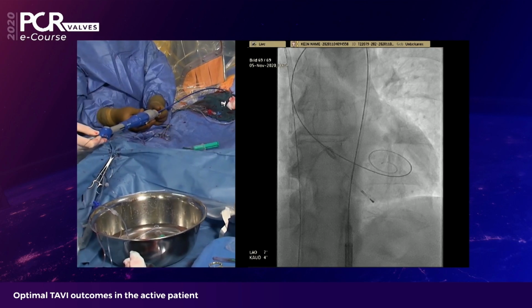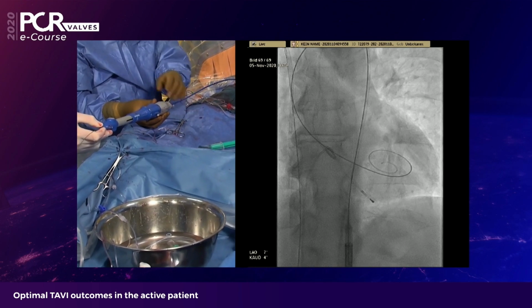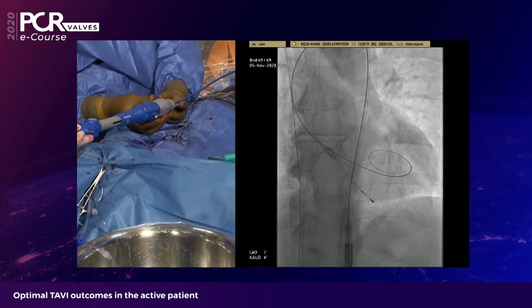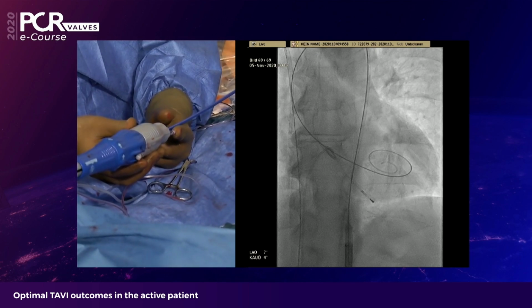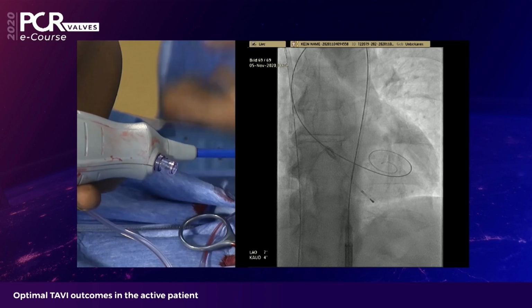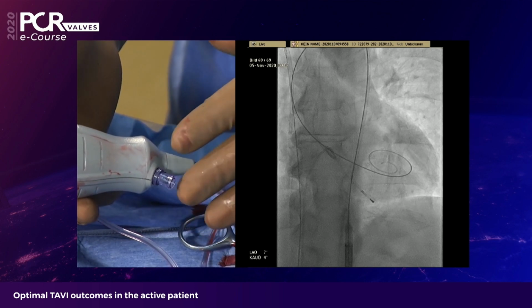Moving the camera, if you can see it, yes, with the head camera. We have the flush port now at 3 o'clock. And we know that this flush port marks one of the C-tabs, which overlies the commissures. So if you see this on a graph, you will easily understand this. So these are the markers we have.